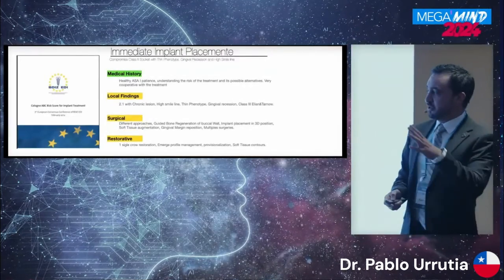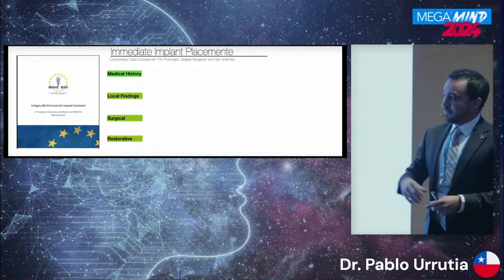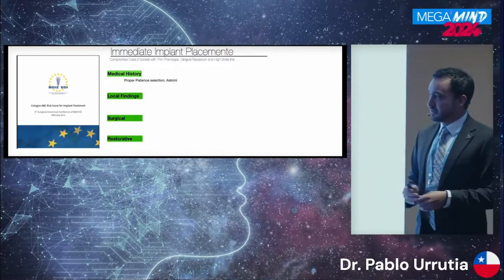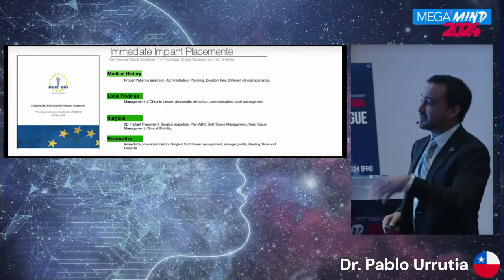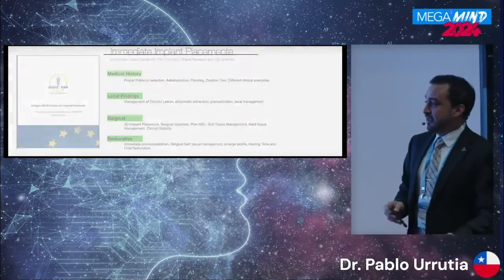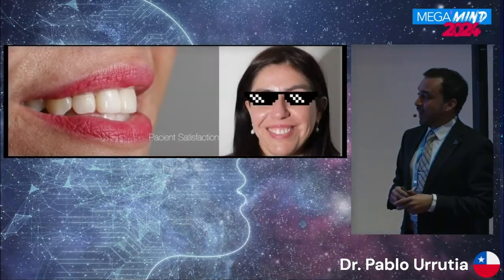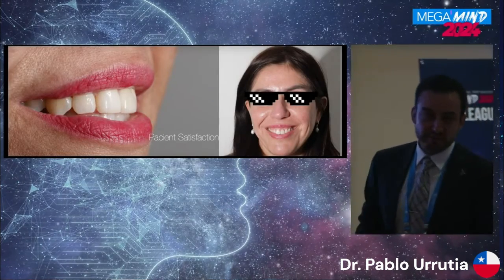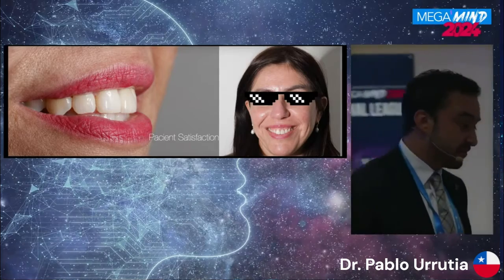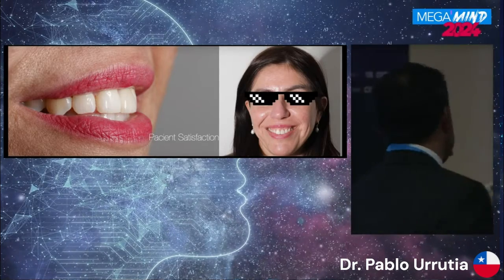As you can see how we resolve every situation in the staged approach with this kind of treatment. You can see the local findings, the surgical, the restorative, and of course, more important, the patient outcome and satisfaction. Okay, so the patient was well, so the team of us was well.